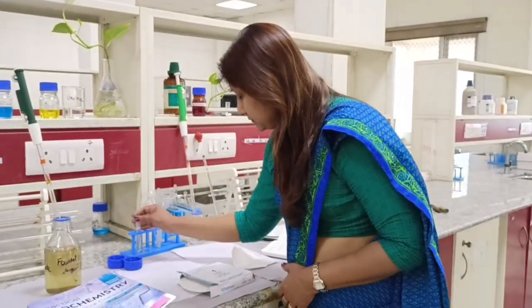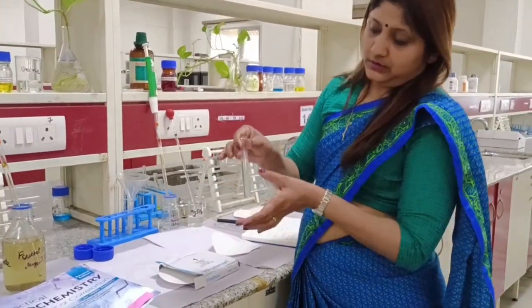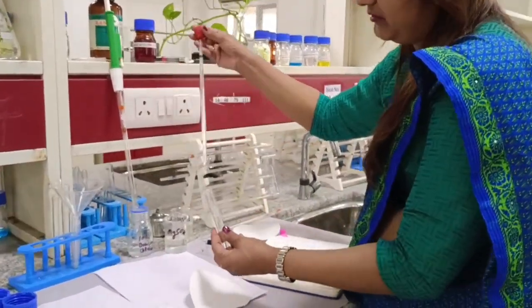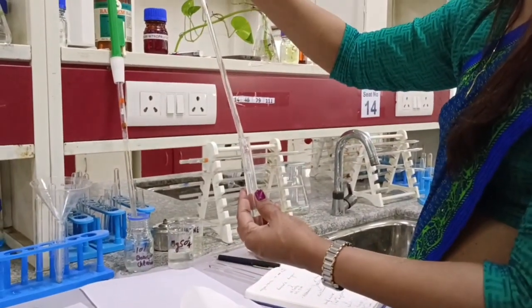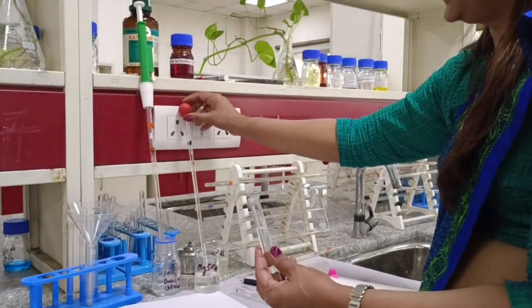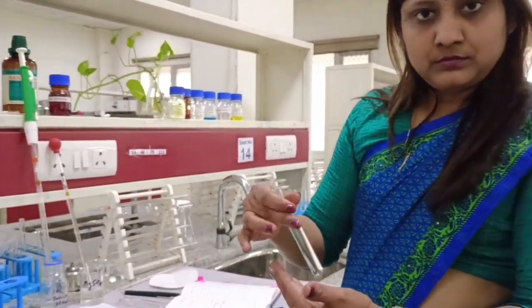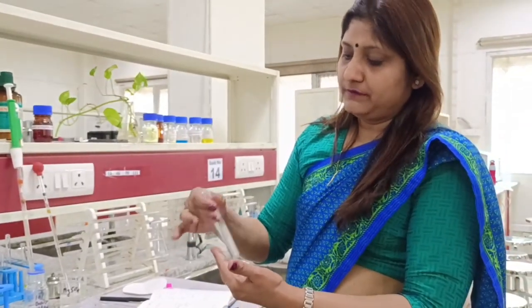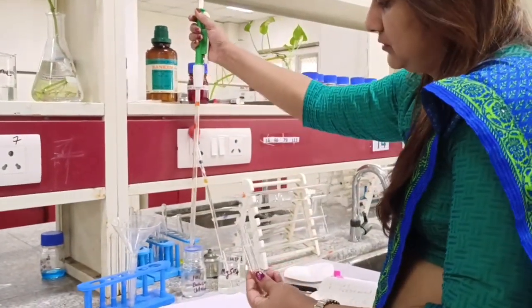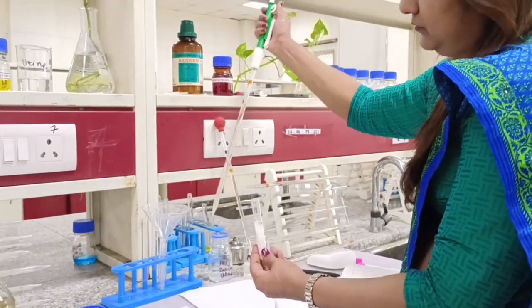To perform the Fouchet's test, take 5 ml of urine in a test tube. I have already taken 5 ml of urine. Now, add 1 ml of magnesium sulfate to this urine sample, then mix it thoroughly, boil it, and cool it so that magnesium sulfate is properly mixed in the urine solution. After cooling, add 6–7 drops of 10% barium chloride.